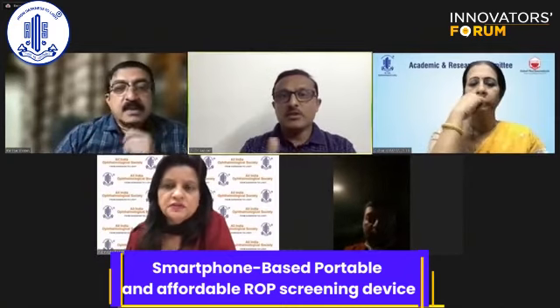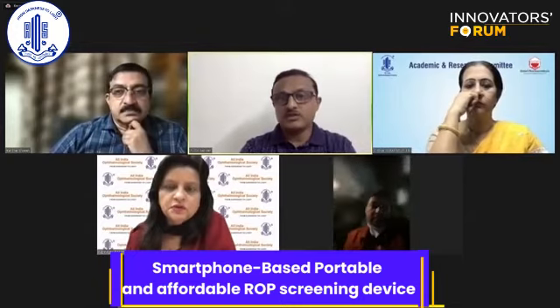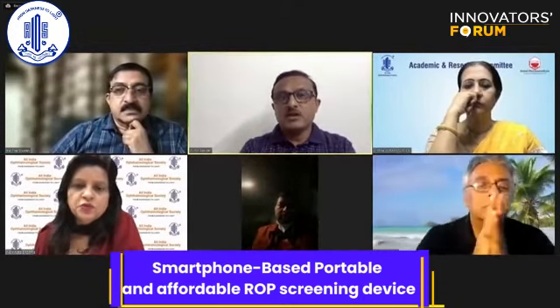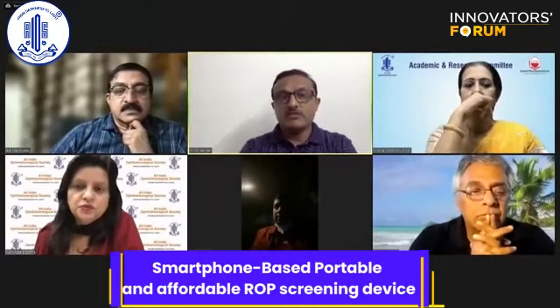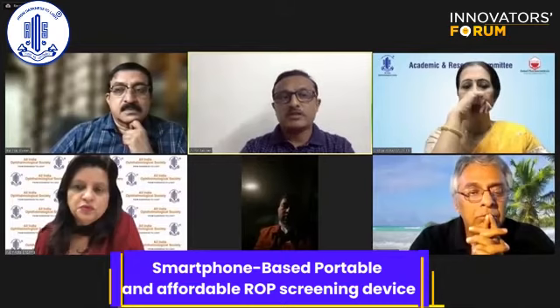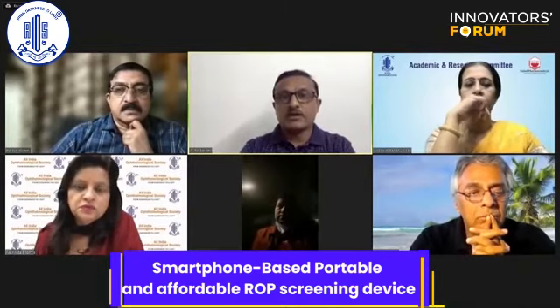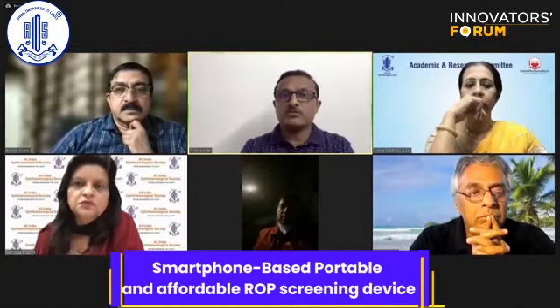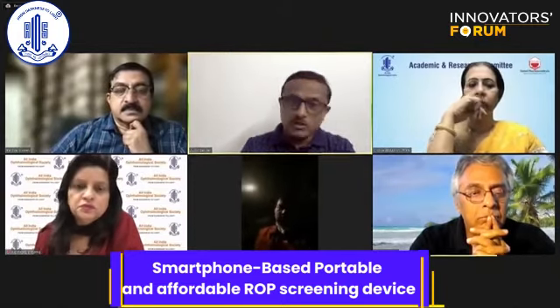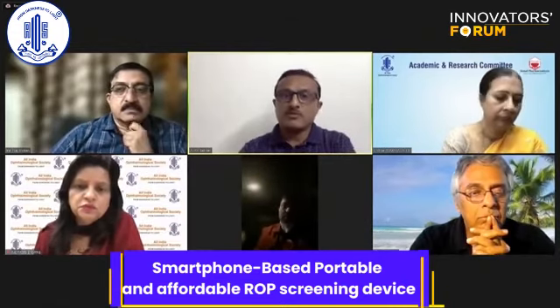Yes. The device costs around 8,000, and it's extremely light. The material is very, very light. And very recently, we've come to know that we are very fortunate that the Department of Science and Technology has accepted our proposal for a grant for further development of this device, particularly for ROP. And we are trying to distribute it to all the peripheral ROP centers. So that's a big plus point.